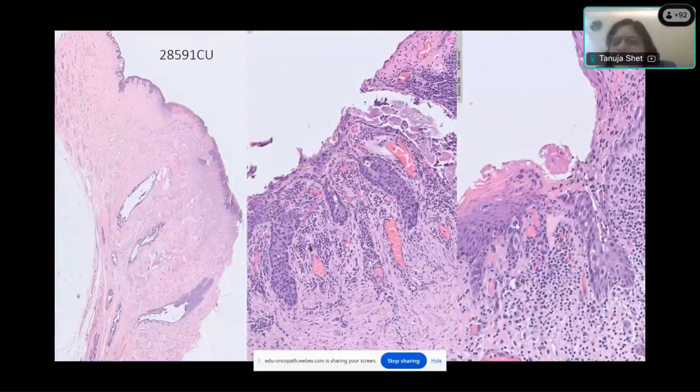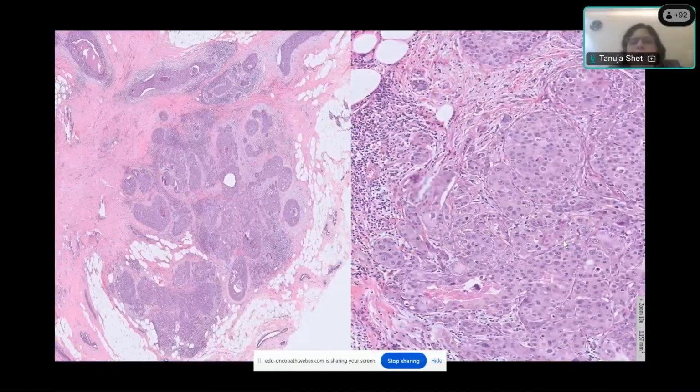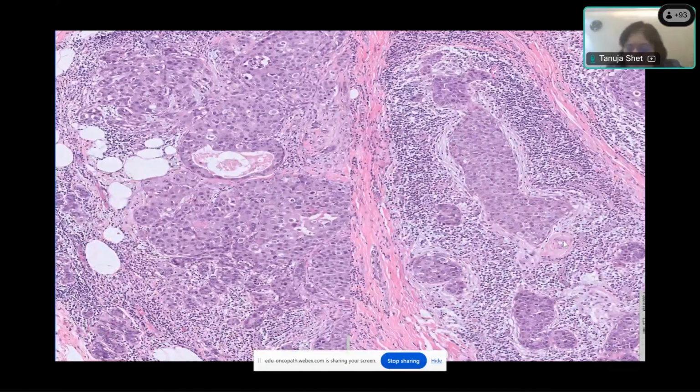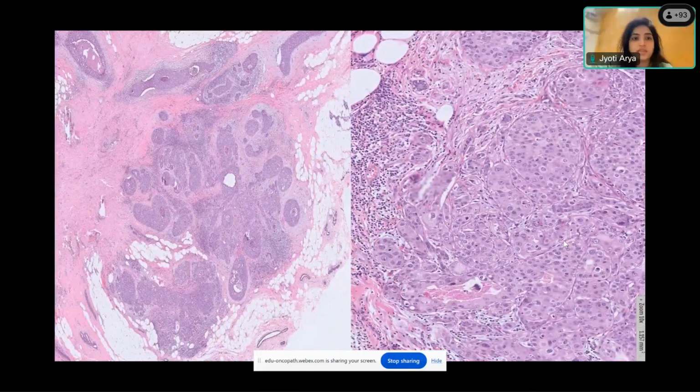You can see that there are cells within the epidermis, and it's an ulcerated epidermis. The most important thing is to look at what is down below that is spreading to the nipple. And lo and behold, that's the mass that we had. All sections are from the mass, which was 2 centimeters odd. And now what do you see? Now you have to describe this for me. So invasive or in situ? Ma'am, invasive. Invasive. Okay.